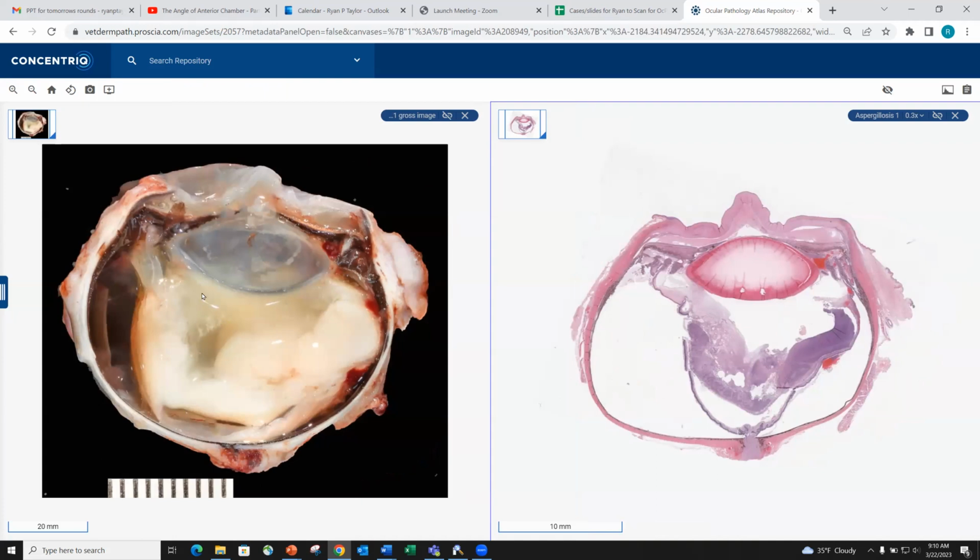With how most people photograph their ocular lesions, and with the majority of lesions that we photograph at Coplow, the gross image is going to be a direct correlation to how it's showing up on the slide as well. So left should be left, right should be right, in the sense of on the screen, not necessarily the left side of the globe or the right side of the globe. But dorsal should be dorsal, ventral should be ventral on how they're oriented. The exception to that is if we go back and take an image of the other half of the globe, then the orientation is going to be a little bit different. But for the majority of our pictures, the way you see it in the gross image is the way that it appears on the slide as well.